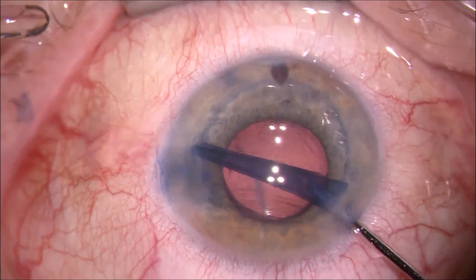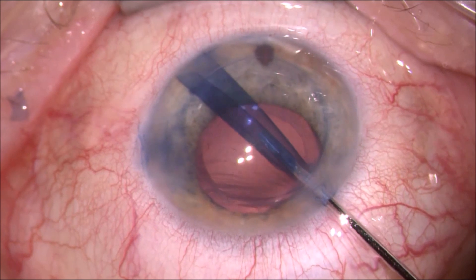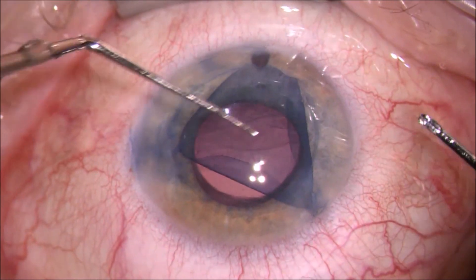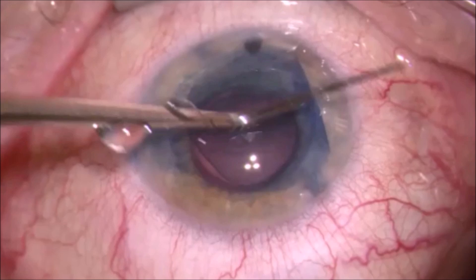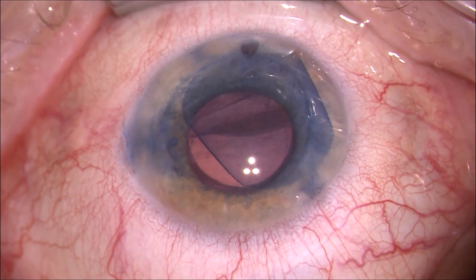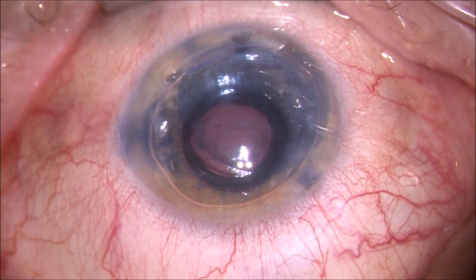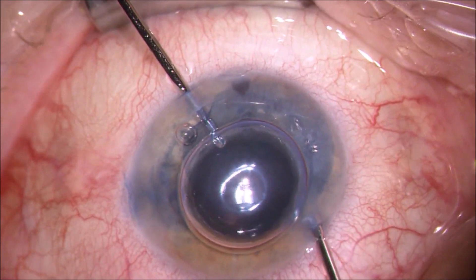Watch me — I have lowered the infusion pressure to zero and switched it off while injecting, and I've caught the membrane with my irrigation cannula. Now I'm using a Göttinger spatula to go inside at the stromal side of the rexis, with the eye in hypotony. Watch at the 10 o'clock position — I'll freeze frame it for you — there is the arrowhead, the spearhead, or sharkfin mark that gives you the orientation of the lamella. If your sharkfin or arrowhead mark isn't clearly visible, an IOCT might help, or ensure during preparation that you can see the sharkfin exactly.